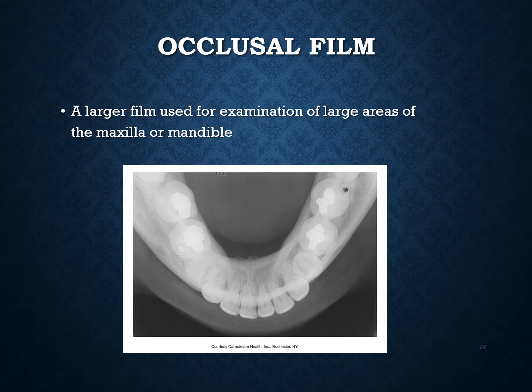We wouldn't want to use this to detect cavities, right? We're not going to be able to get a very good diagnostic image as to whether a patient has bone loss or cavities from this type of radiograph.